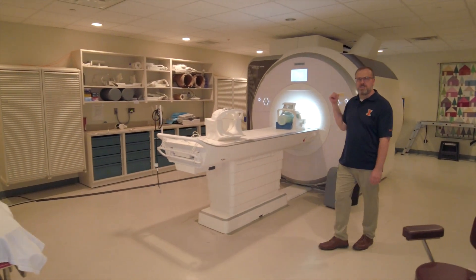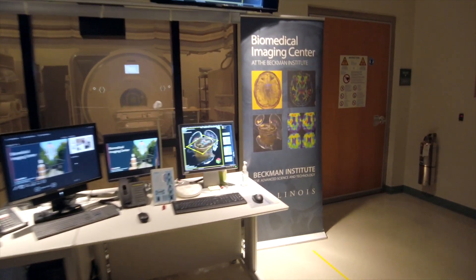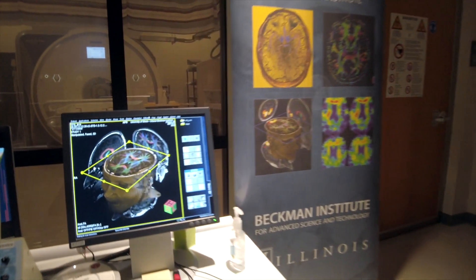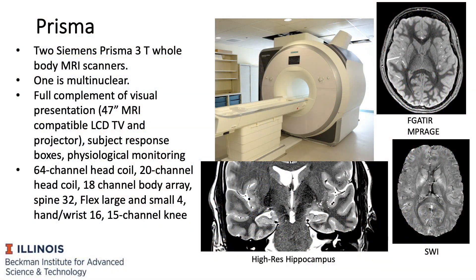This is one of our two state-of-the-art 3T Prisma systems. We have two of those here in the Biomedical Imaging Center inside the basement in Beckman Institute. The 3T Prisma has 80 millitesla per meter gradient amplitudes and 64 channel receivers on both systems.